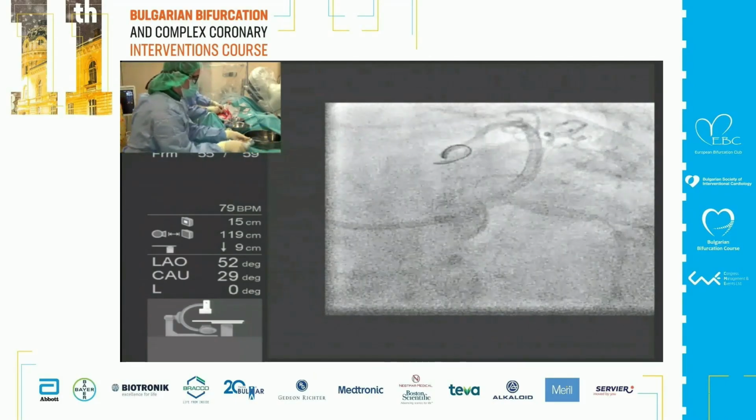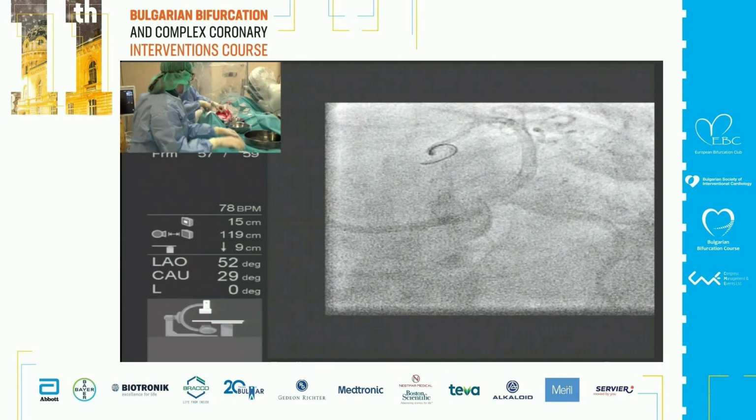Seems good, huh? Yes, you have to do the IVUS. I want to see. A long time ago, when we did left main intervention in patients refused by surgeons in the 90s, we began a program at the beginning of 2000.